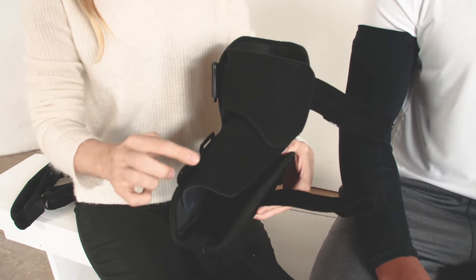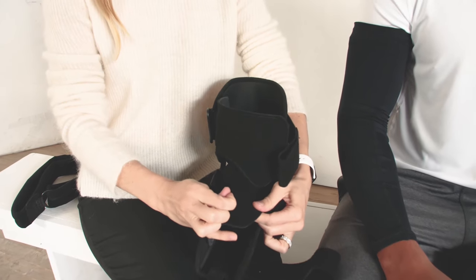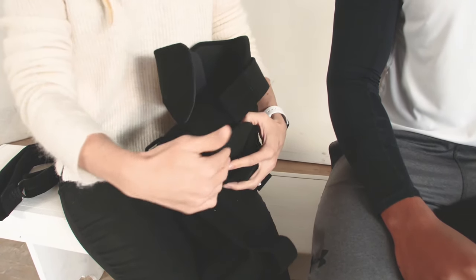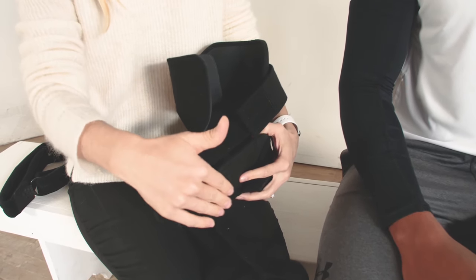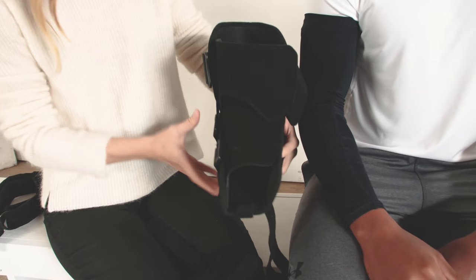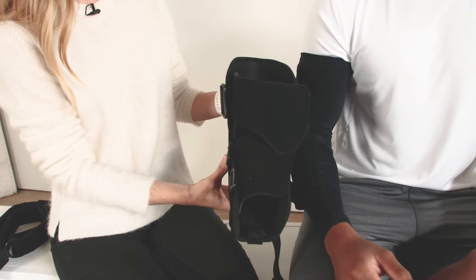In the event that I needed a left-handed brace I would undo the Sarmientos here, undo the strap, flip it over so that the D-ring was sitting on the other side of the brace, because we don't want the buckles rubbing against the body. So you'll see here that it's set up for his right arm as we're going to apply it.